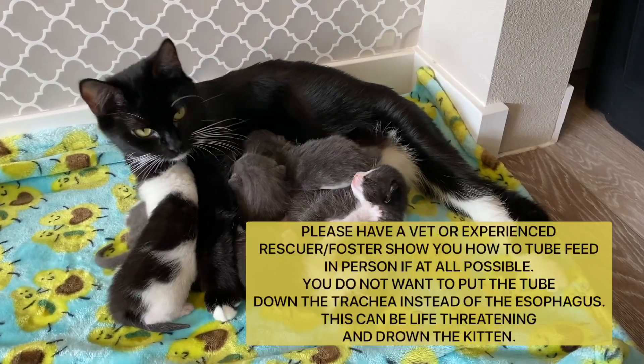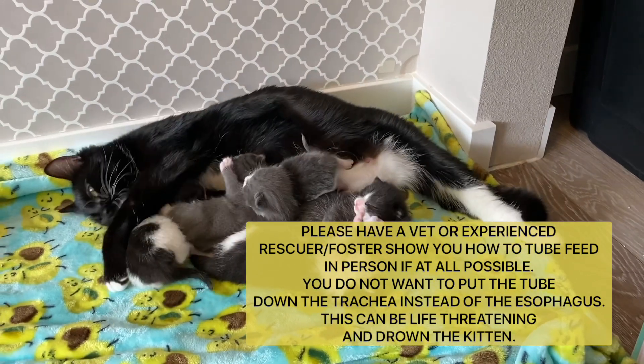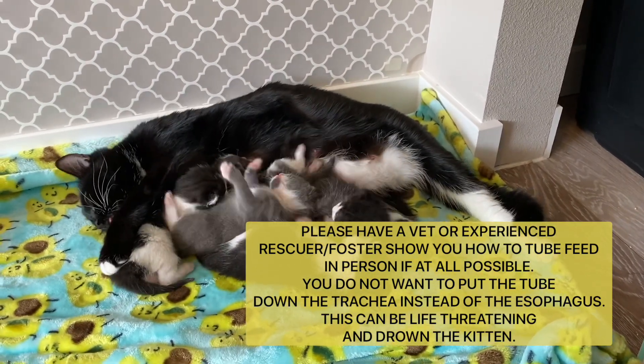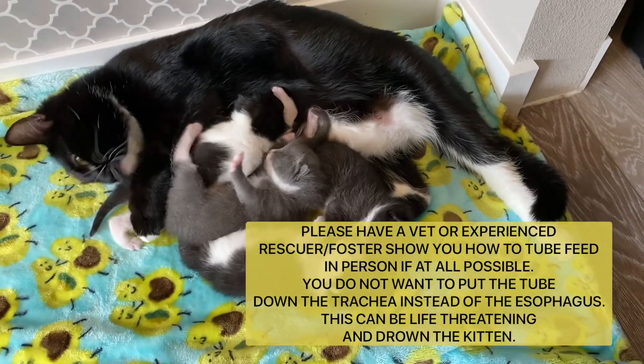I do want to start by saying that this can be dangerous and potentially life-threatening if done incorrectly. So please, if possible, have your veterinarian or vet staff show you how to tube feed in person first.